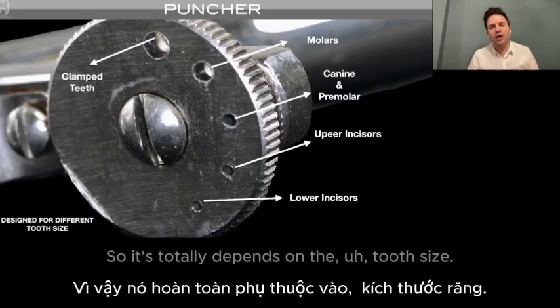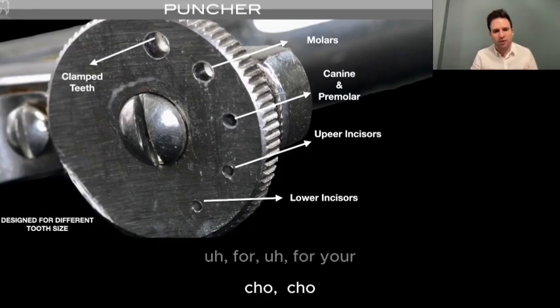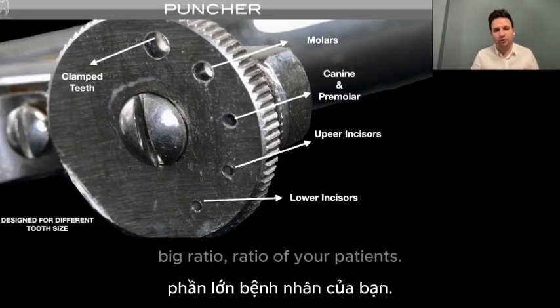So it totally depends on the tooth size, but mostly you can prefer that size for the big ratio of your patients.